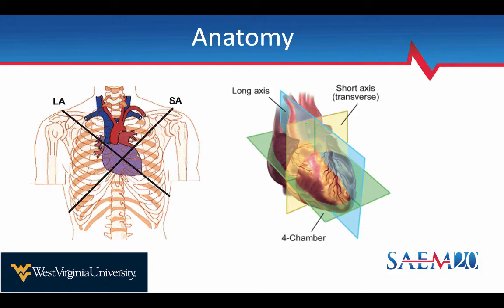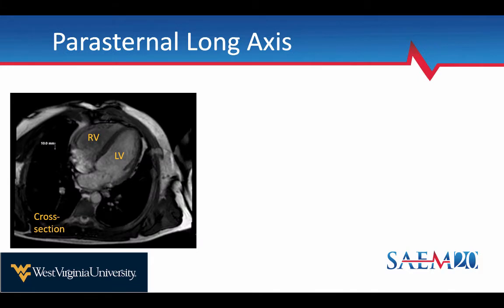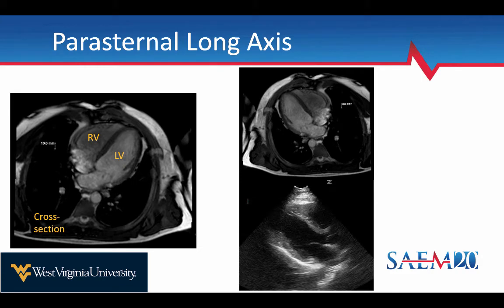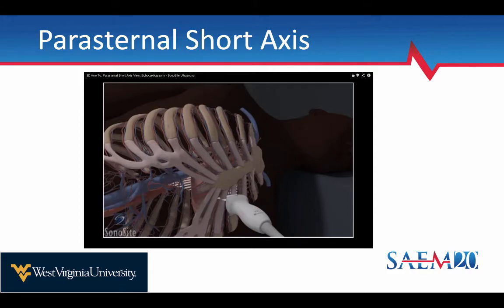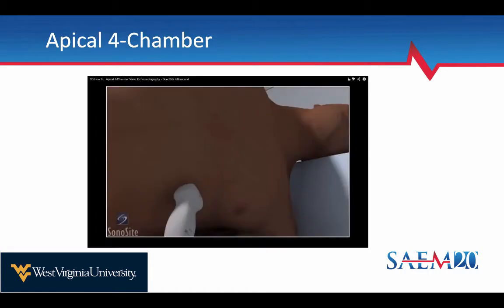These are just a few samplings of things we've used in the past, where we have these static images and we have these cut planes that look like this. We'll take these different slices showing the image side by side. I've even used scenarios where I tried to take old pictures from other anatomical courses and tried to show the correlations between that and what that looks like on the echo screen, to varying success. Sometimes we'll take anatomical images and try to, again, show the projections of what the anatomy looks like. These are all pretty variable in how effective they are.